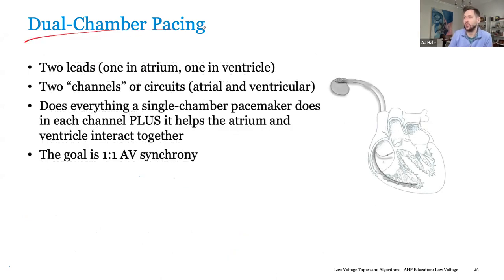We will get into dual chamber pacing on a different day, because Lord knows I've already talked long enough for y'all and you probably need a break. But the idea with dual chamber pacing, just keep in mind there's two channels we're having to deal with. And we'll go through all that.